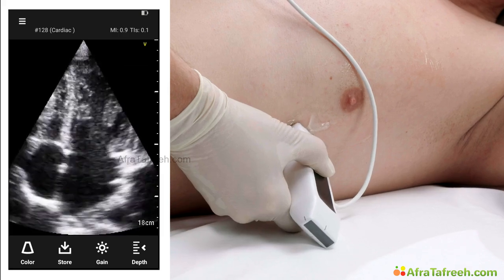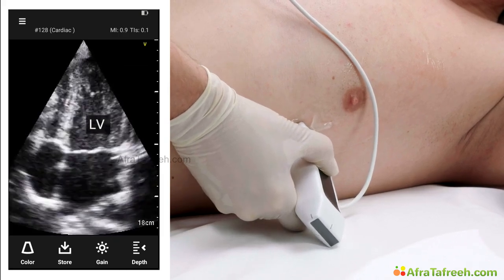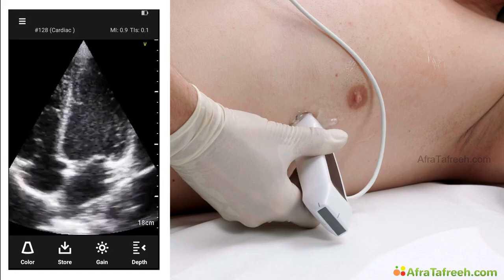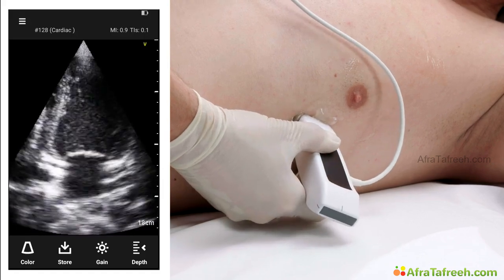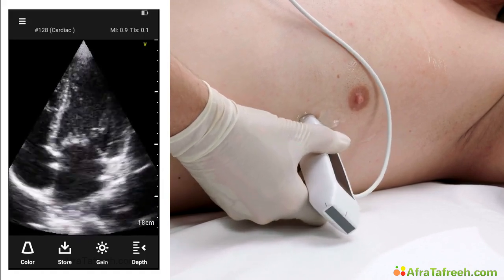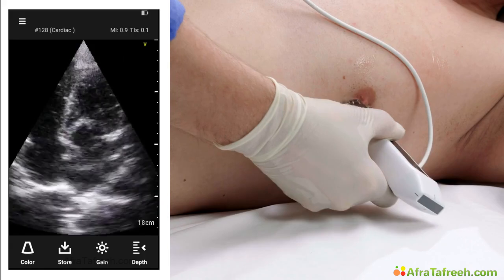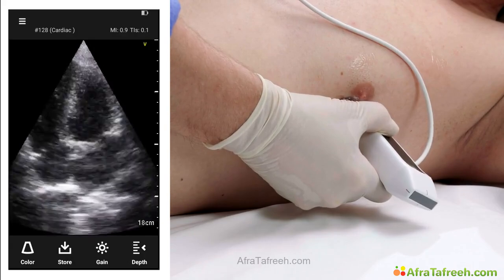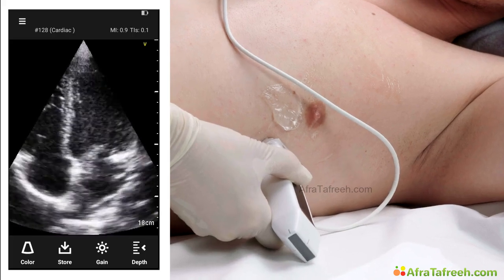This would be a very nice view of all the 4 chambers: left ventricle, left atrium, and right atrium. Of course, you can turn and tilt the transducer as well to optimize your image. Look what happens if I rotate counterclockwise. All of a sudden, the right ventricle will vanish. You don't want to have that view. If you move the transducer up, you will get a ventricle which is a lot shorter. But whatever view you get, it's just important that you see the left ventricle, because that's all you need to estimate left ventricular function.